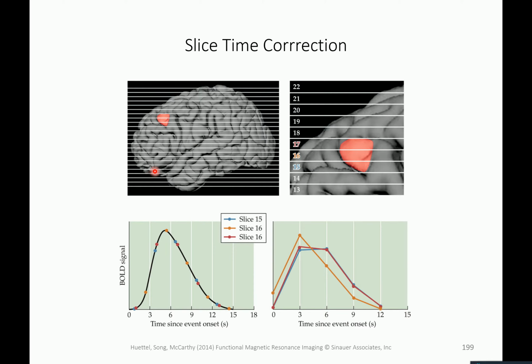The other problem is that you always treat the data from one volume as one time point. Although the data are effectively acquired for a given slice, or a given point in Z space, at different time points, if you analyze the data, you treat all data from one volume as acquired during one TR.